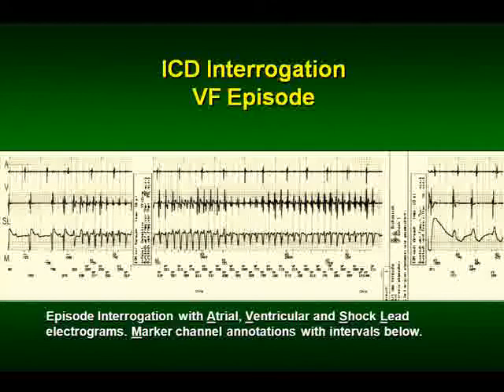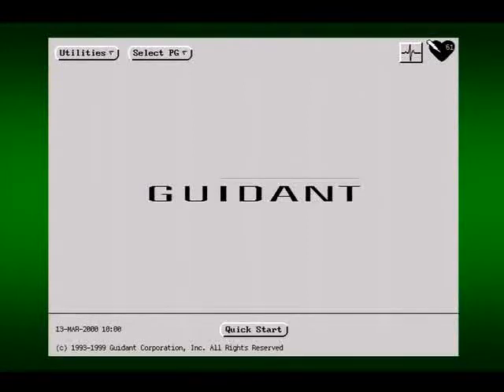Unfortunately, at least in many series, at least half of the shocks that are delivered are so-called inappropriate shocks because they're delivered for rhythms other than VT or VF. In order to know that, you have to be able to interrogate the device.